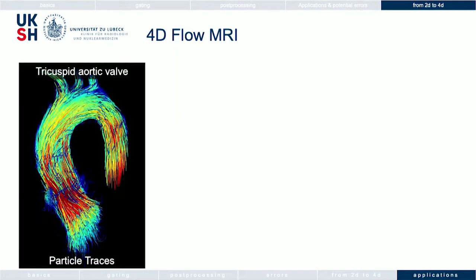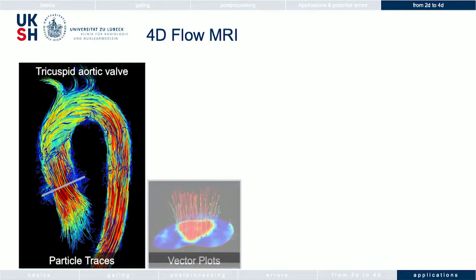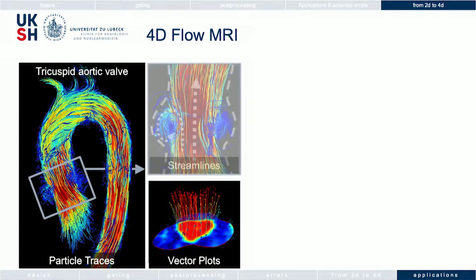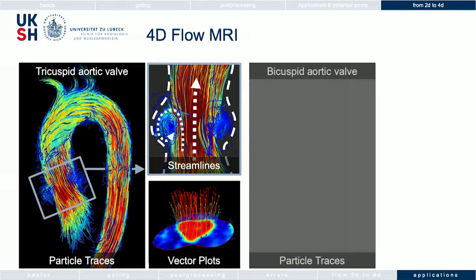And since we cannot do a lot with the black and white images with the 3 velocity encodings, we have post-processing software to look at the 4D flow MRI data. And here you can see a healthy aorta with sinus vortices in the aortic bulb, the central ejection jet, and you can measure the flow at every plane in the aorta.